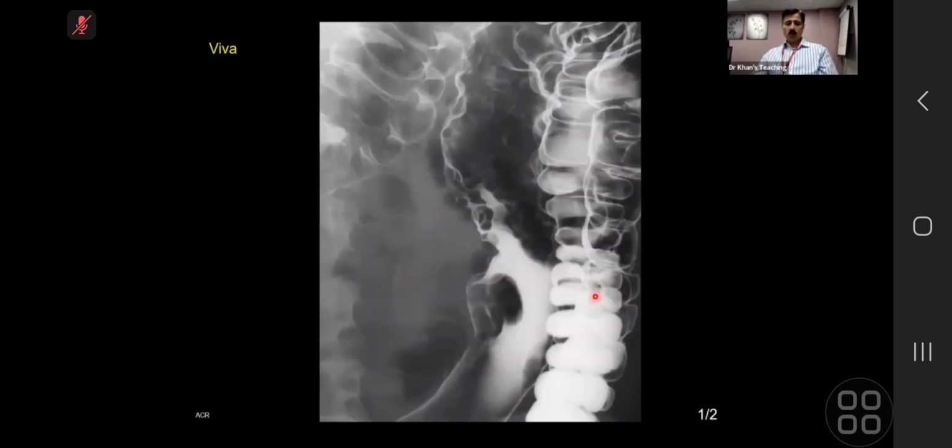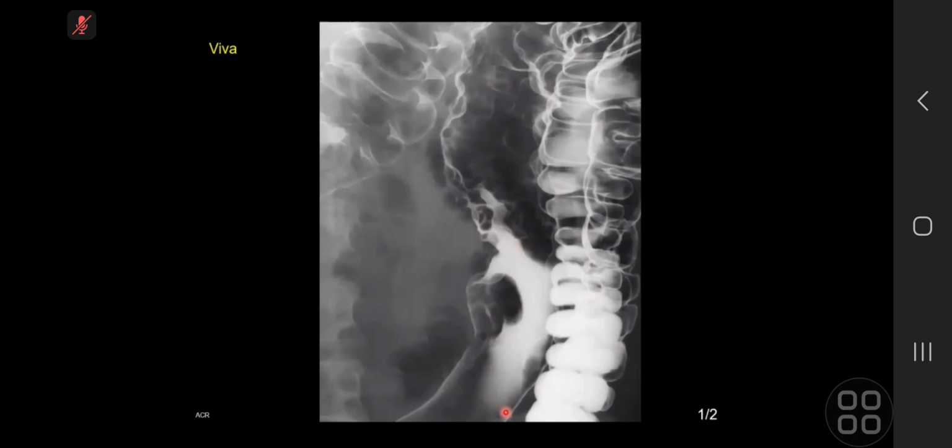Candidate 3, over to you. What's happening here? So I've got a double contrast enema, because I can see all large bowel here, and I can see there's this loop of bowel in which there are ovoid areas where there's no contrast in it, and multiple lucent ovoid areas within the loop of bowel.